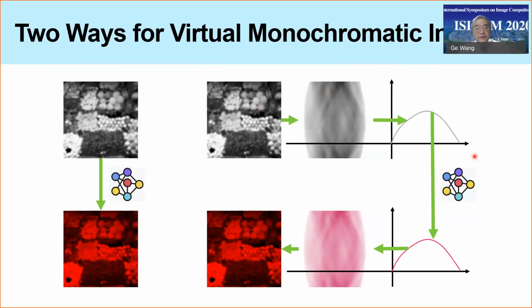And with polychromatic Beer's law, you couldn't do line integral processing accurately. So this is not perfect. This is the gold standard, so you get a perfect profile. We see the opportunity to do machine learning from this projection profile, not so accurate, to the accurate one.